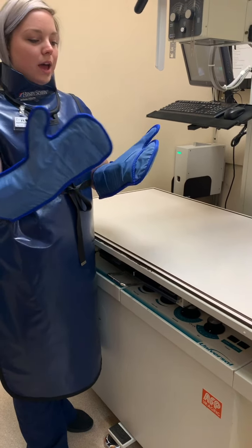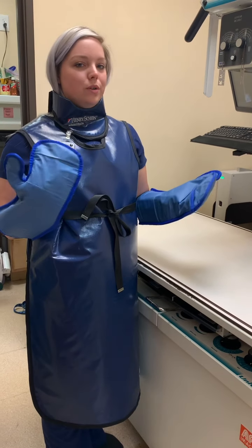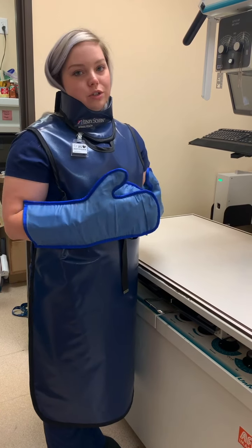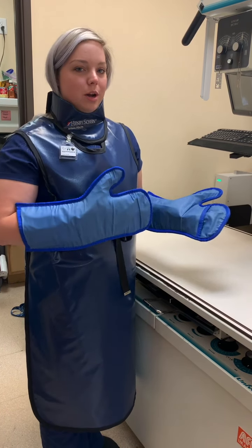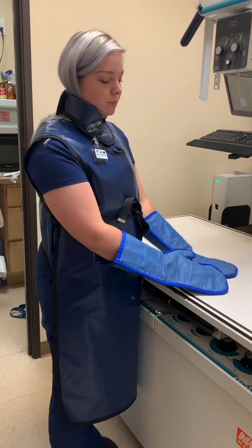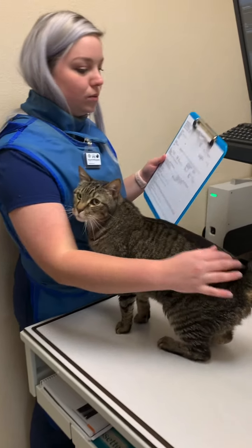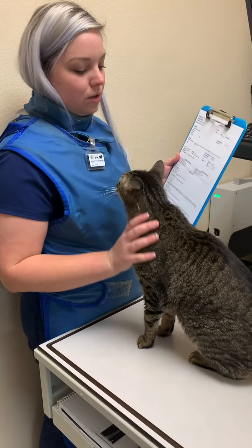You can also have safety goggles, which we don't have here. We just look away whenever we are shooting the exposure away from the primary beam. And that is PPE. Now we're going to do the radius ulna x-ray.